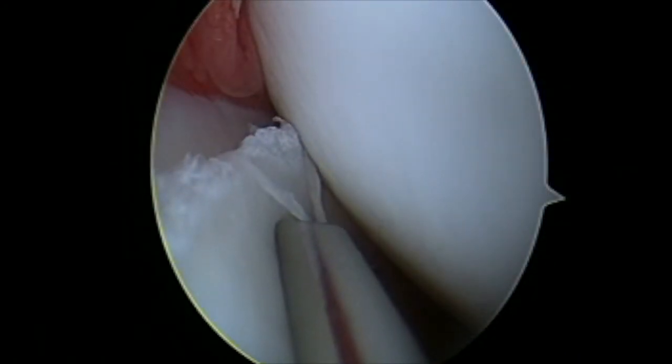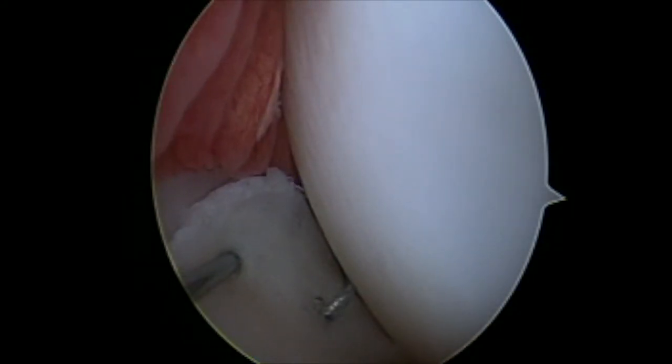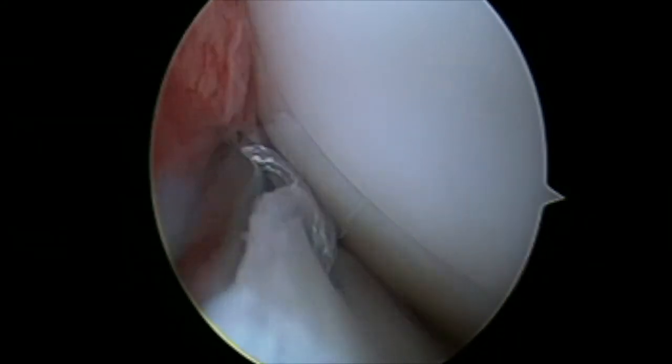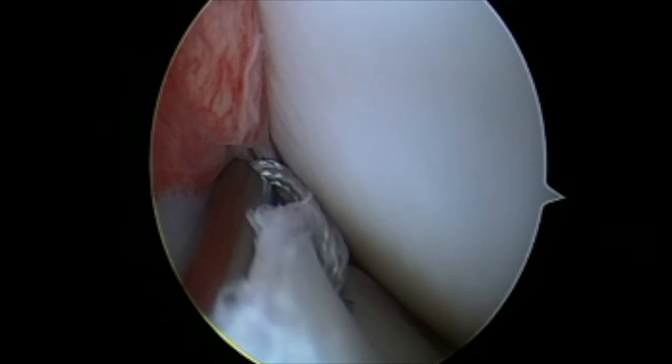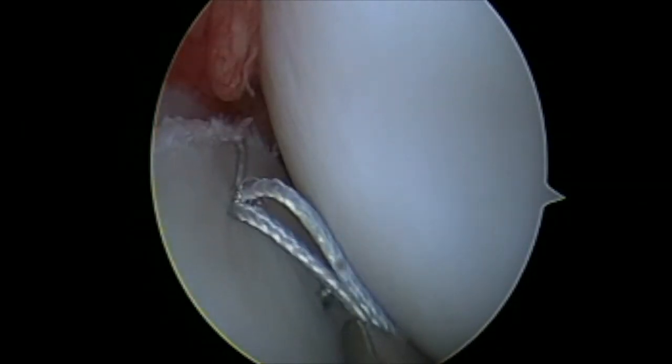I am now using a zone specific cannula and firing a set of needles with fiber wire suture. These sutures are going in a vertical meniscus capsular configuration, which is the most robust type of repair.